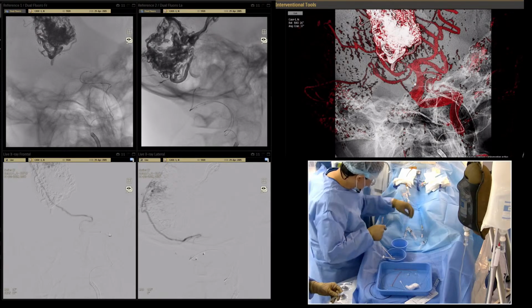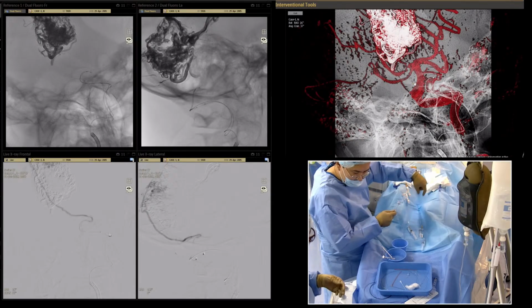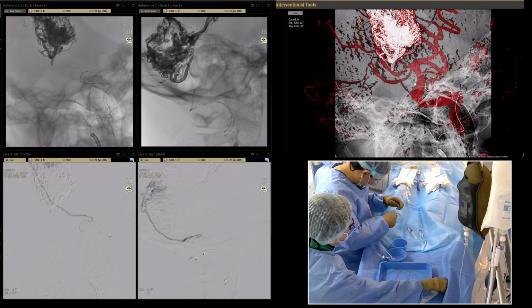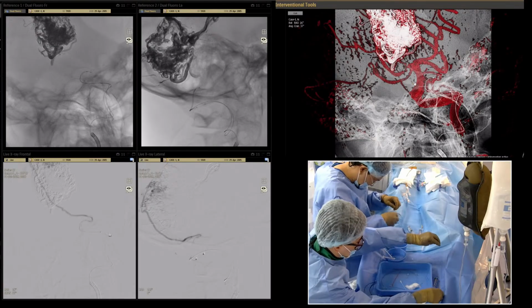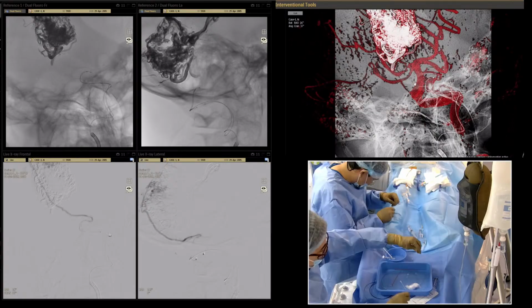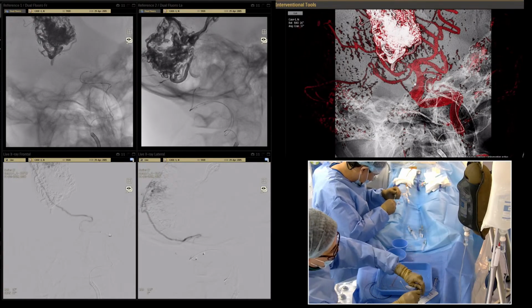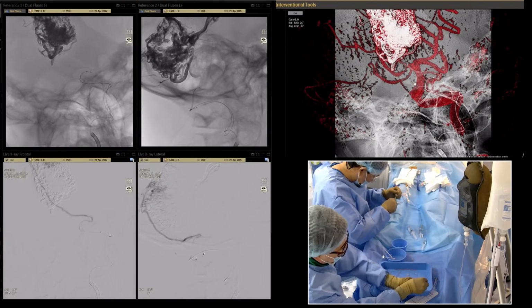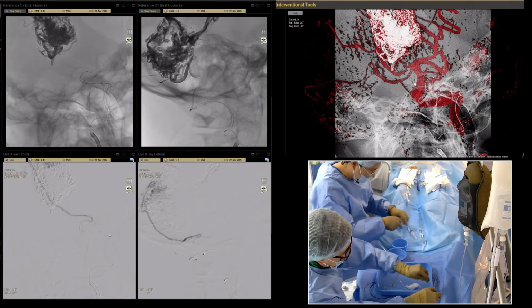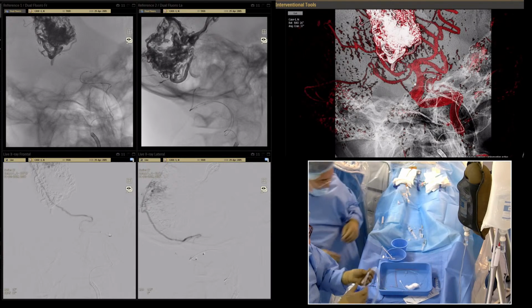Okay. Let's send the... Hybrid. Okay. It's not going. It's damaged. It's damaged.